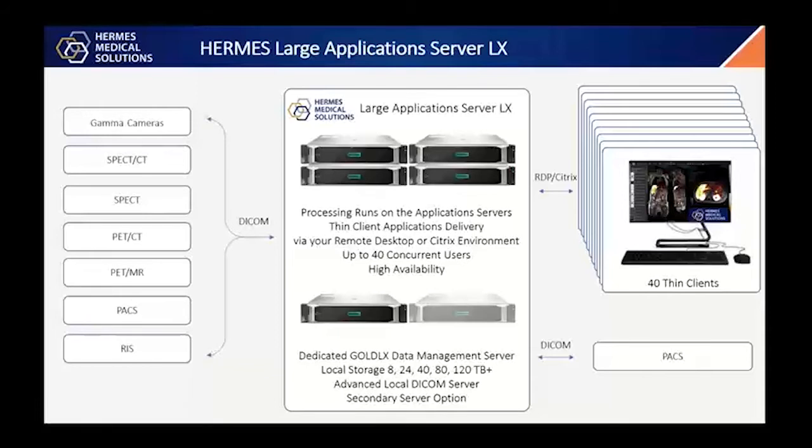One of the ways to possibly simplify this is to have this type of facility, or the ones that I showed you earlier, not on site, but off site somewhere. You may have a question about virtualization. Now, the problem with virtualization is, in other words, can we use this on hospital hardware, a server farm you already have? It depends on the graphics capability, because as I mentioned before, the graphics capability is key to the performance of a lot of our software, the advanced software.